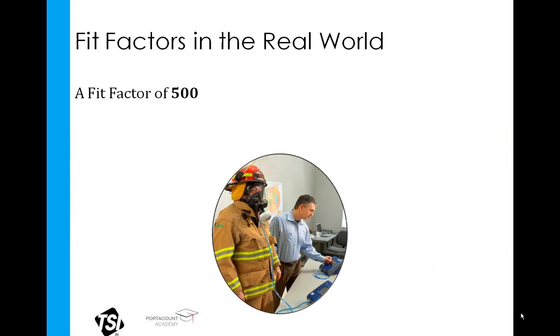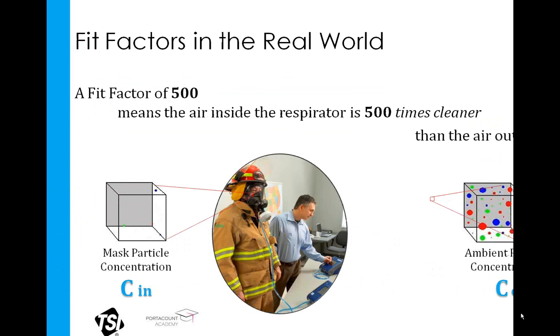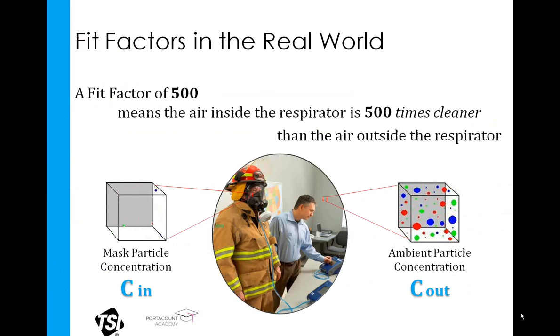So in the real world, this would mean that if you had a fit factor of 500, the air inside of the donned respirator is 500 times cleaner than the air outside of the donned respirator. Consequently, a fit factor of 1,000 would mean the air inside the respirator is 1,000 times cleaner than the air measured outside the respirator.